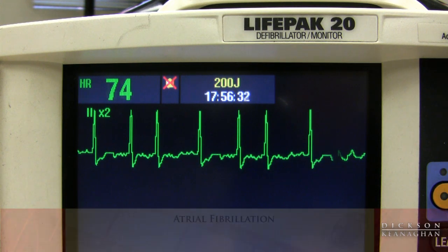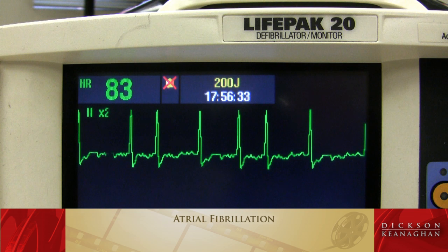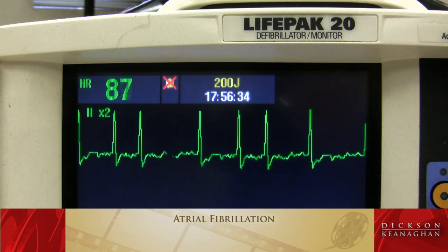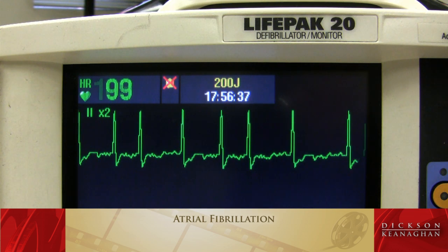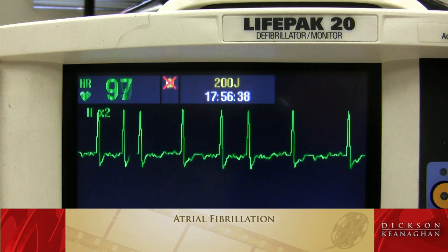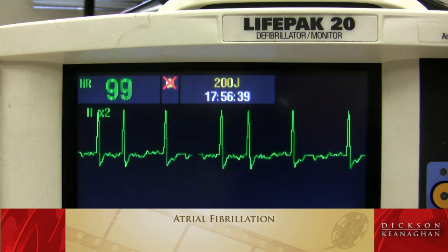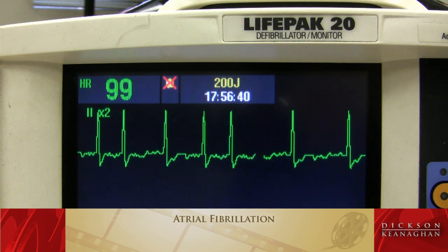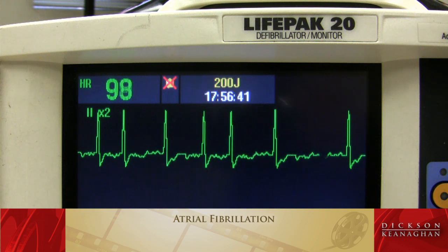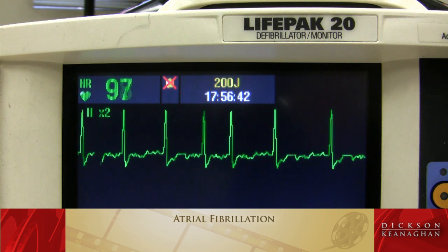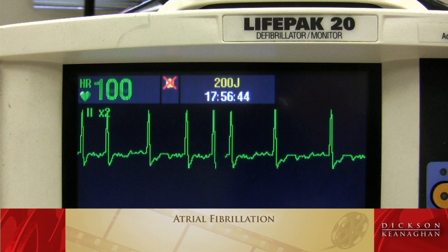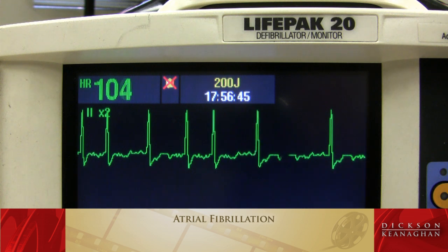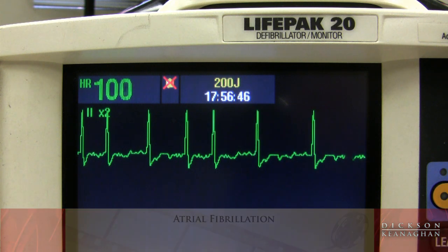Atrial fibrillation. Multiple irritable foci firing rapidly in the atrium, causing that very chaotic baseline. The R2Rs are never regular and there are no discernible P waves. Atrial fibrillation.